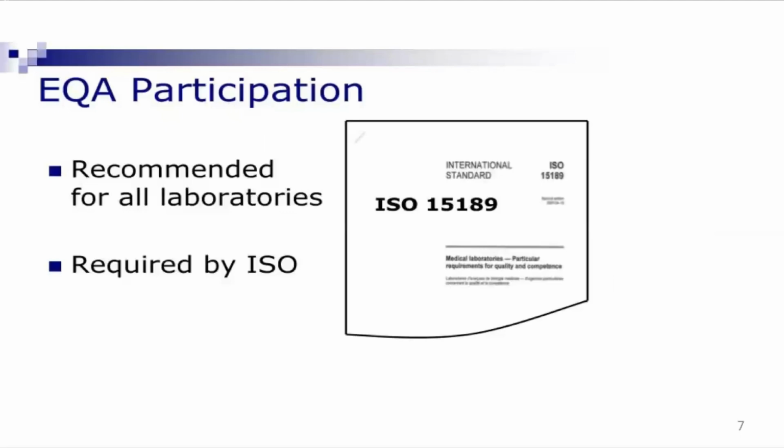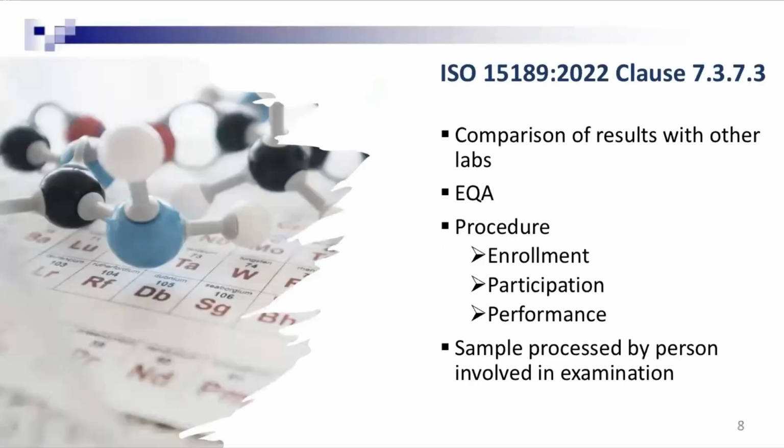EQAS participation is a requirement of ISO 15189, which we use for the development of a quality management system and for the accreditation of our medical laboratory. It is mentioned under clause 7.3.7.3, EQAS participation. We do the analysis and submit our results. Then our results are compared with other laboratories and we get information.